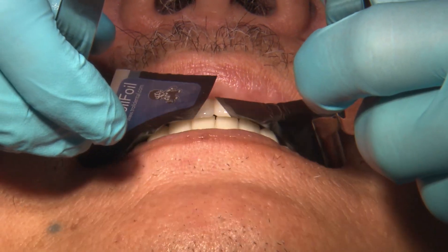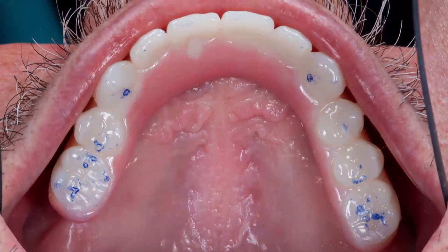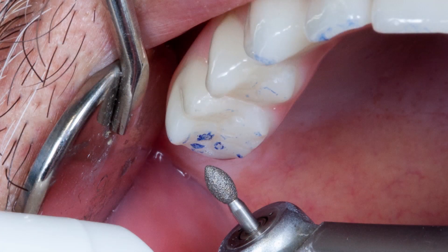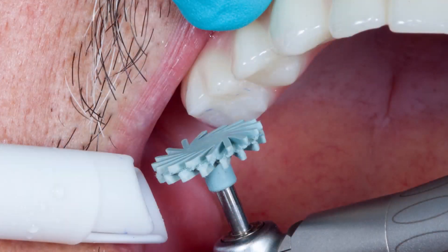Once the prosthesis is in, I'm using those two miller forceps to check my bite and check the occlusion. Then I start with diamond burrs for any gross adjustments and finish up with those dialyte burrs to ensure a nice smooth polished finish. A high polish on all of your zirconia restorations is highly recommended because it definitely limits the wear of the opposing dentition. If it's highly polished, it's actually one of the best things for natural enamel as far as dental prostheses go.